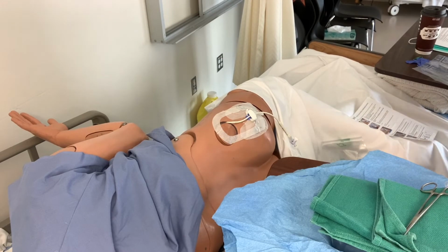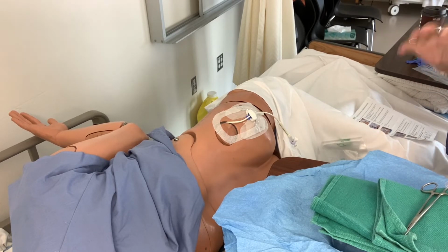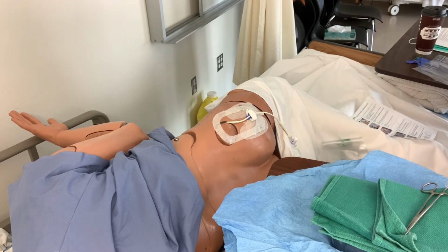Okay, for this part of the video, this is going to deal with the flush. So we're going to say that the dressing change is not due. The dressing is clear, transparent, it's occlusive, it's not lifting, and there's no drainage underneath it. The dressing looks good. So this flush has been ordered every 12 hours, and it's been ordered to have 20 mils of sterile saline. So we're going to take it from the flush perspective, as if you were just flushing. Again, I'm going to follow the policy and procedure of Health PEI.